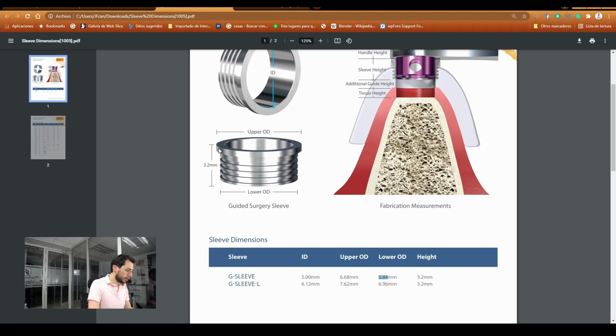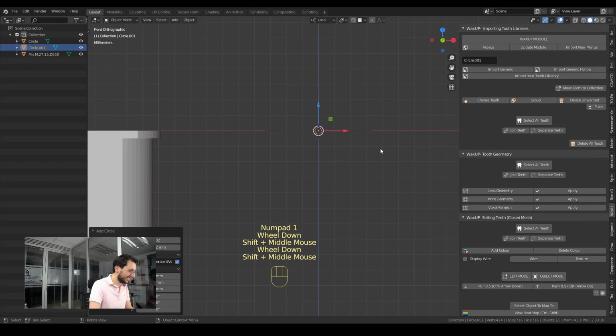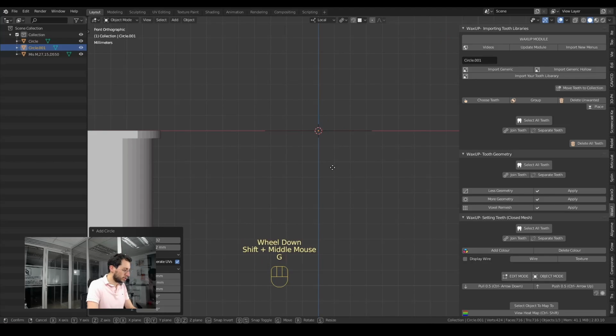Now this part, or the height of this element, is 3.2. I can design this exactly with that dimension, pressing G and then Z, and move it downward 3.2 millimeters. Since it is downward, I press the minus sign and it goes down.